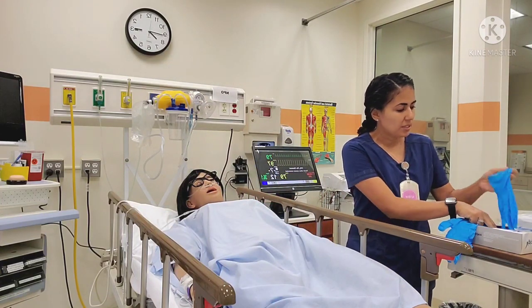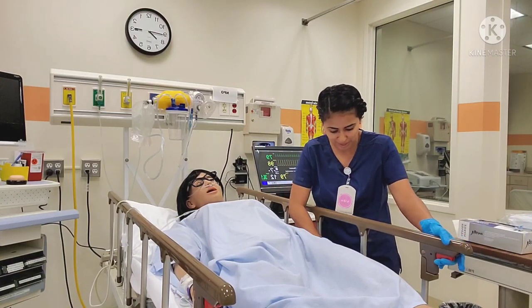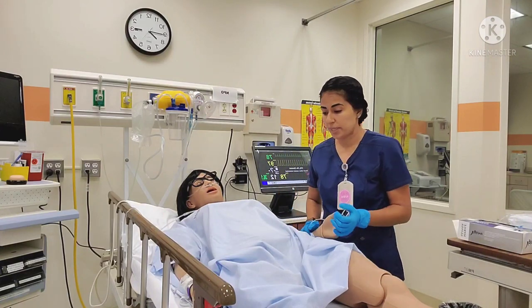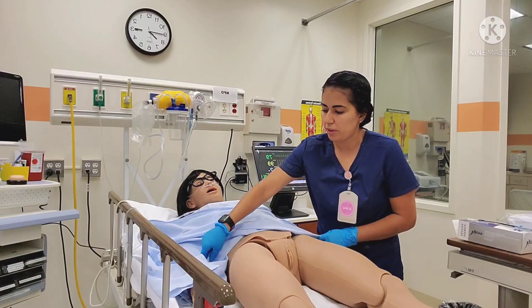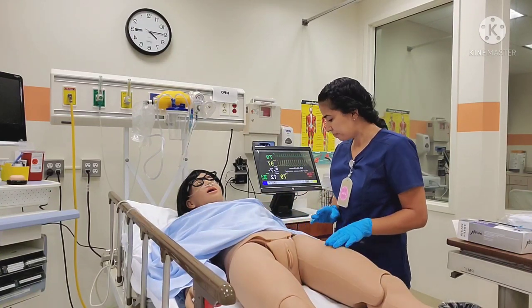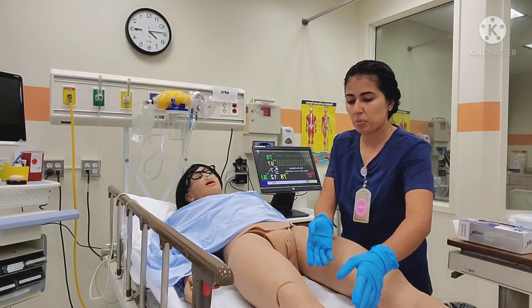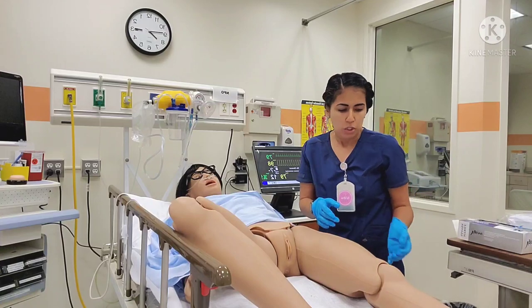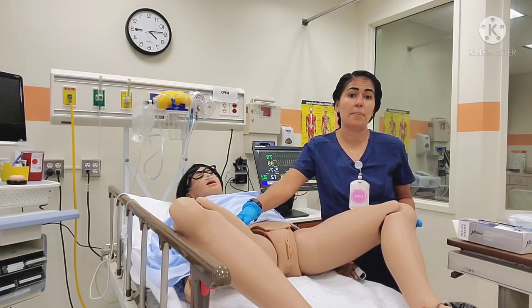I'm going to put on some clean gloves. We would provide privacy and close the curtain so the patient is not exposed. I'm going to expose my patient — in a sterile procedure we do not want the gown touching the sterile field. Now I'm going to put the patient in the optimal position for inserting the catheter, bending her knee. If I have a patient who's not able to help, I definitely need assistance — a nurse or two to hold the patient's legs.